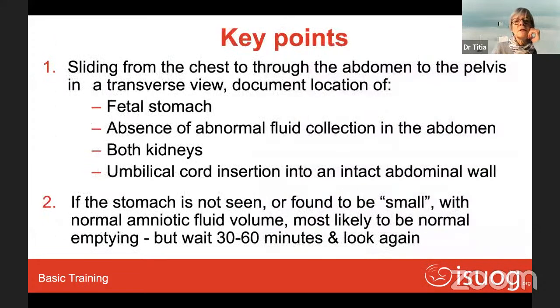Beware of the normal cord insertion, only bowel within the amniotic fluid, free floating in the amniotic fluid, and they need referral. So the key points of this lecture are sliding from the chest through the abdomen to the pelvis in a transverse view. You can document the stomach, the absence of abnormal fluid collections within the abdomen, you can identify both kidneys and you identify the umbilical cord insertion.